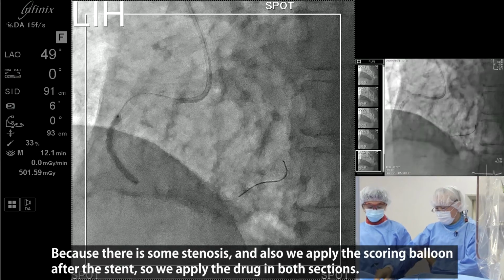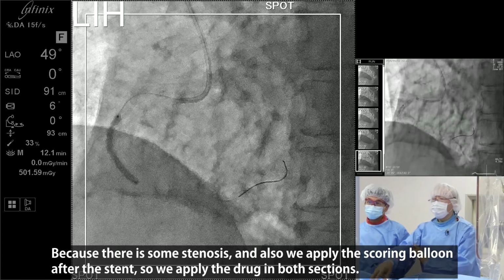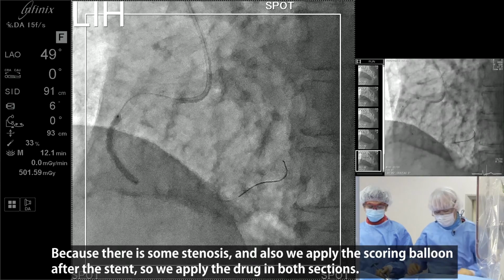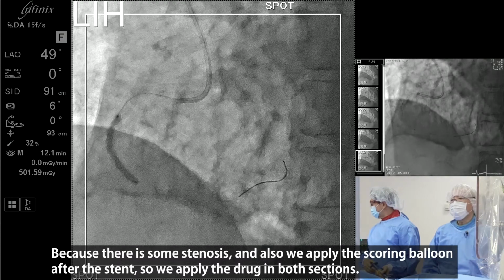Also, we apply the cutting, the scoring balloon after the stent, so we apply the drug to both sections.